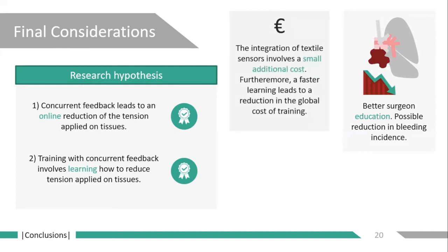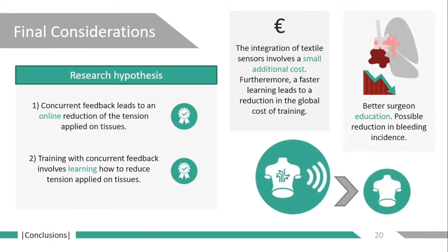And also on another note, the additional cost for the sensorization of the pulmonary vein simulator was very little, and we can say that in the end, training with a sensorized simulator might be better than training with a simple physical simulator.